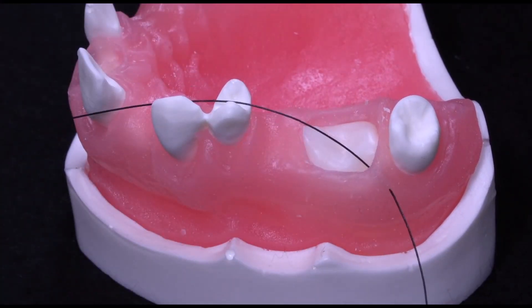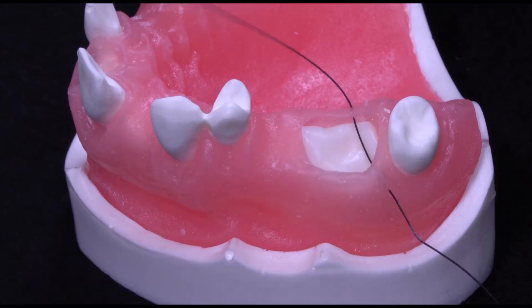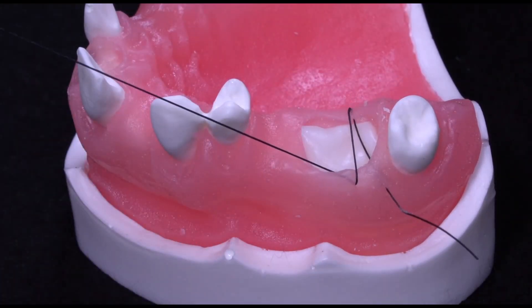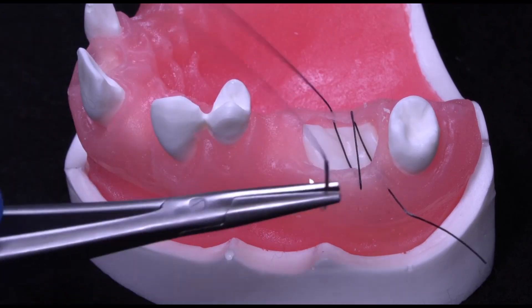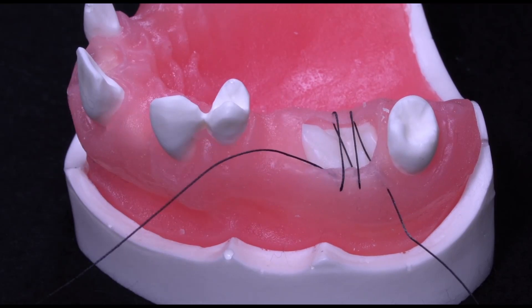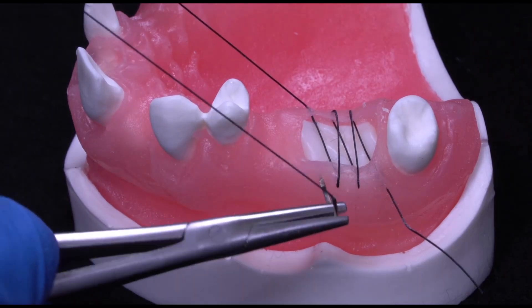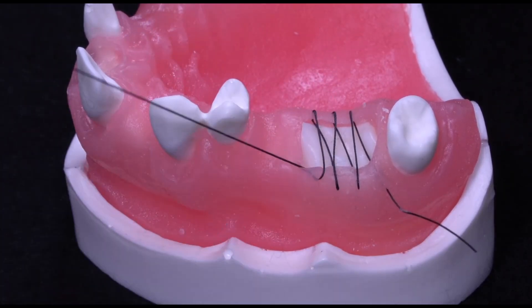To stabilize the membrane, multiple suture techniques are possible. For example, a figure 8 suture can be placed. Or, in this case, a modified continuous suture was demonstrated as it helps stabilize the membrane the entire width of the extraction site, ensuring stability and containment of the graft material.